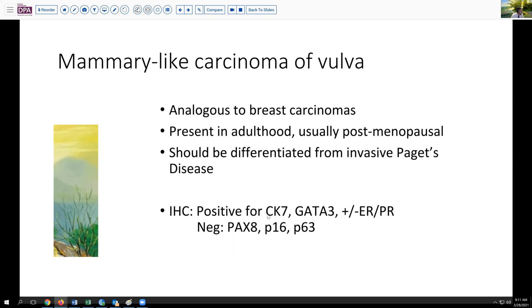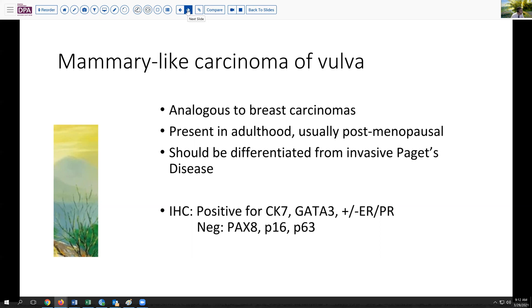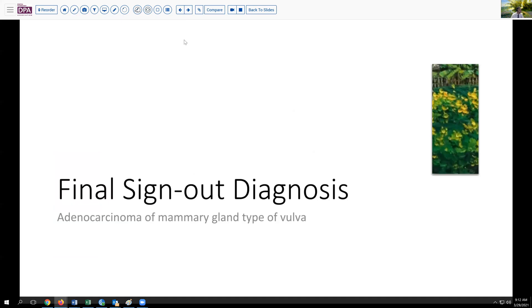As we mentioned, these can be CK7 positive. Additionally, they can be GATA3 positive. Hormone receptors and HER2 can be somewhat variable. These are uniformly negative for PAX8. P16 is usually splotchy or negative. And P63 will be negative in the absence of any in situ component, and would certainly be indicative that there is no squamous differentiation in these tumors. This accounts for a very small percentage of vulvar neoplasms, but it is a recognized type and is presented in the most recent WHO manual.